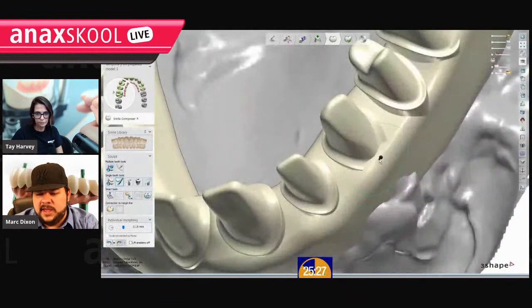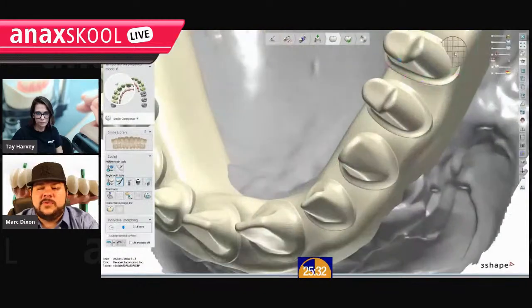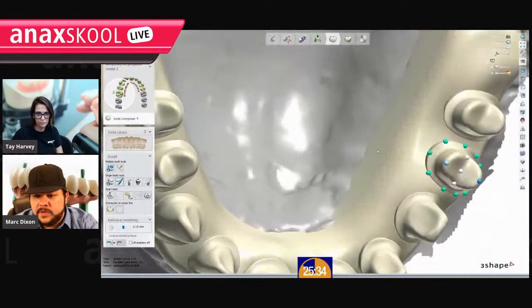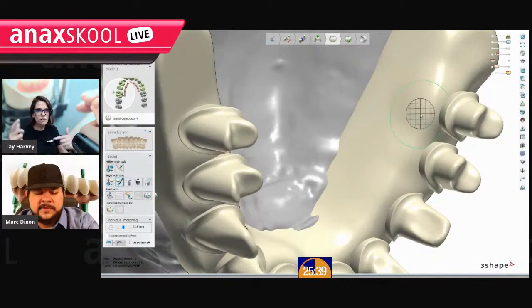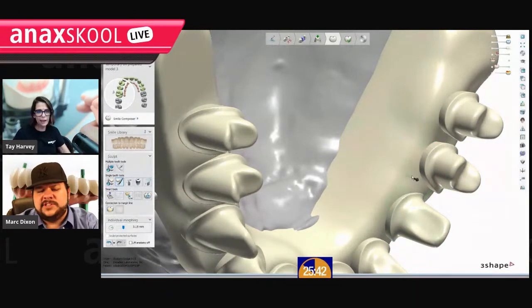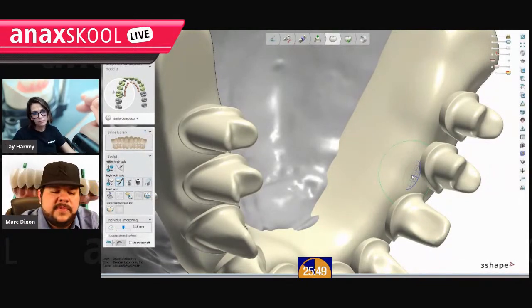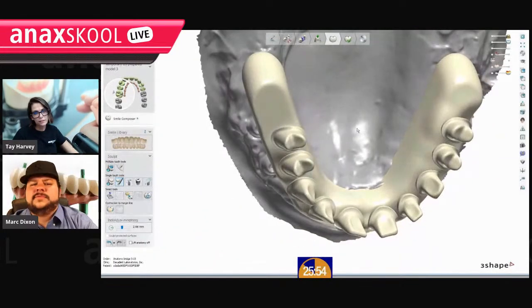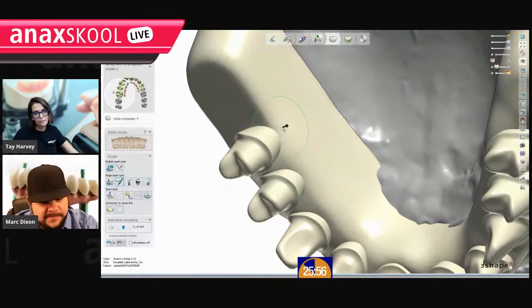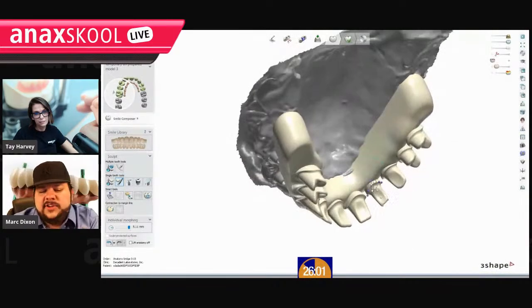I think it's also a Pecton manufacturing issue they could have been having, because people don't understand how hard it is. They just throw it in as PMMA and then they have all these fuzzies and flash. They don't slow down the spindle. There's flash everywhere. There's a few Facebook posts where somebody's like, oh, look, a Pecton, and I'm looking at it thinking, that's not going to work. You're going to be revealing that. But it's hard, and it's good that it's hard.